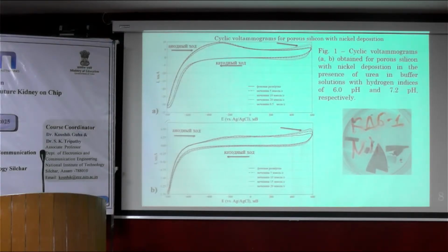And if we change the cumulative surface area of the electrode, and if we change the composition of this electrode by means of any anode or cathode reaction, this will change the form of the cyclic voltammogram that we will achieve. So on the one hand, if we properly calibrate this system, we can acquire some response to the urea presence, but we have to provide a very stable electrode that is chemically resistant to the media that we are going to work with.